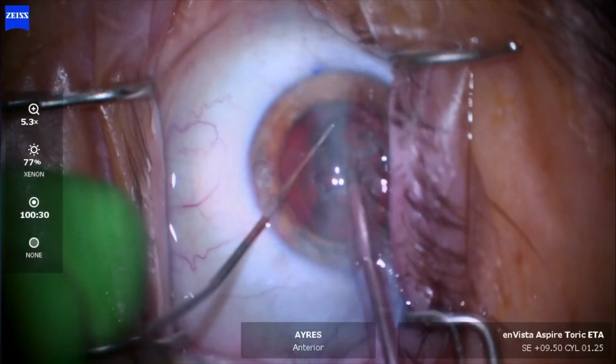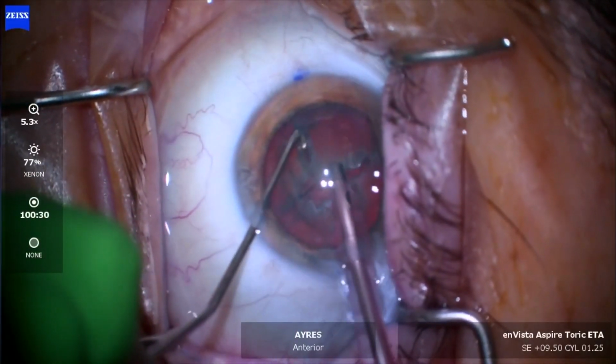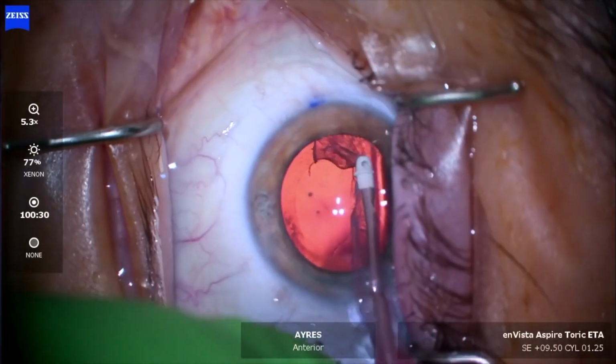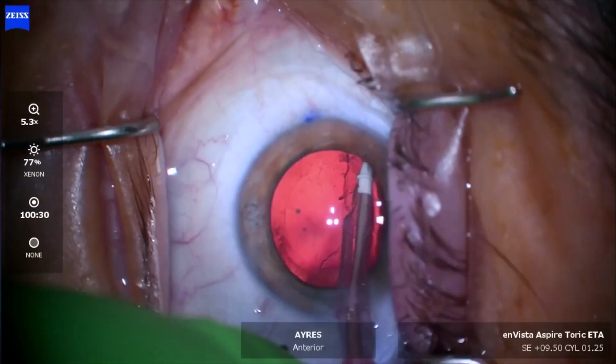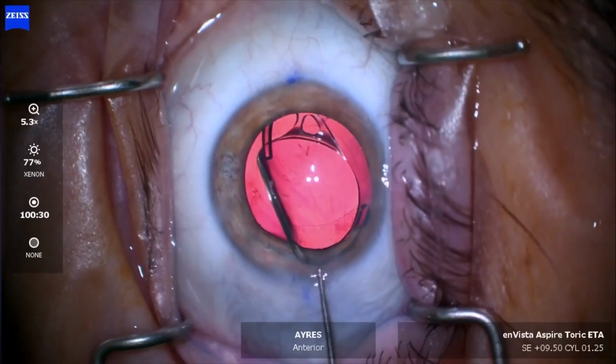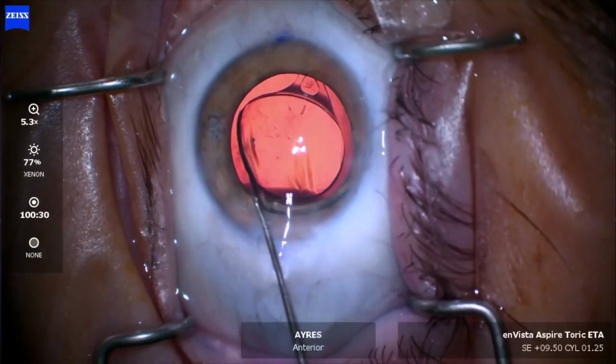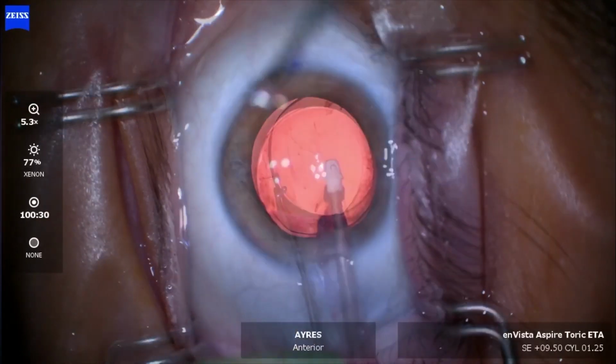Now that the phakic lens is out, we can move on and take the cataract out using our traditional techniques, and the last little bit of cortex coming out. Again, you'll see my reference marks because I still put reference marks on the patients, but you probably don't need to because this patient was also imaged with our IOL Master and the planning done in Veracity.